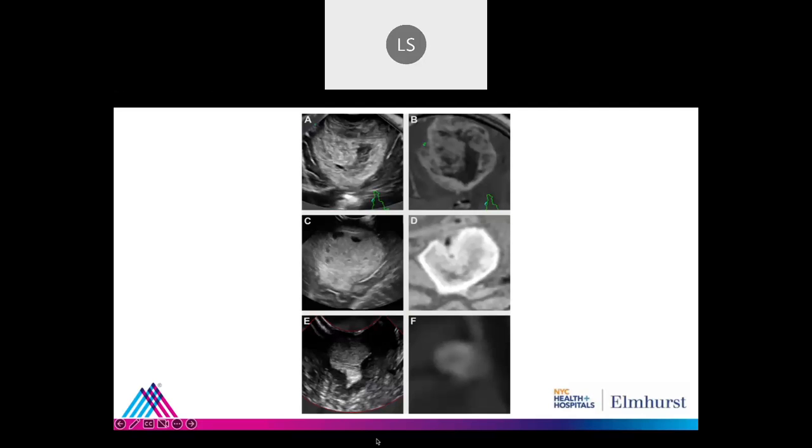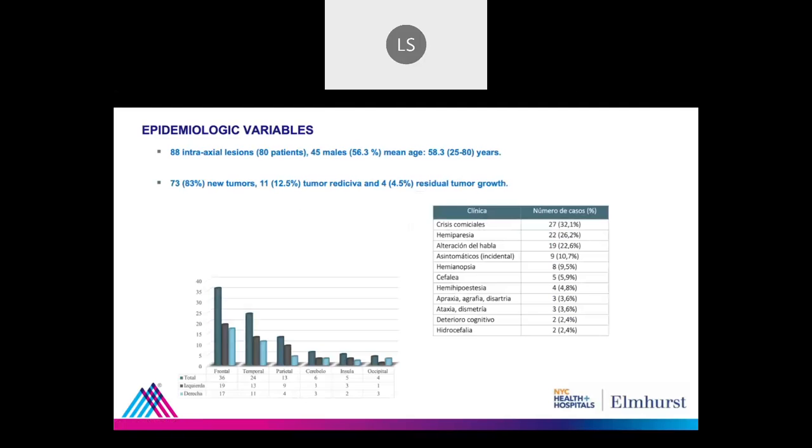And this would be a grade 3 on the ultrasound, and a grade 2 with the same magnification on the MRI, because it was a very small metastasis and you could not see it clearly.